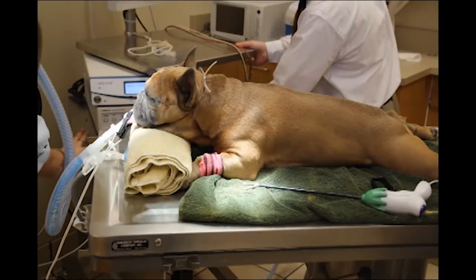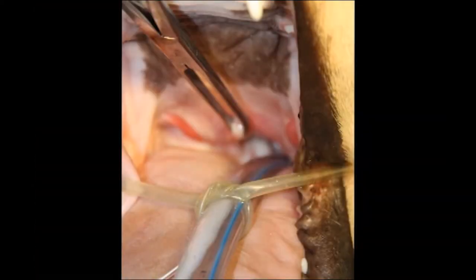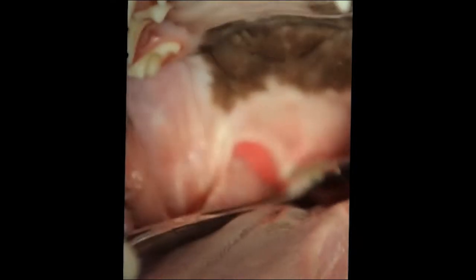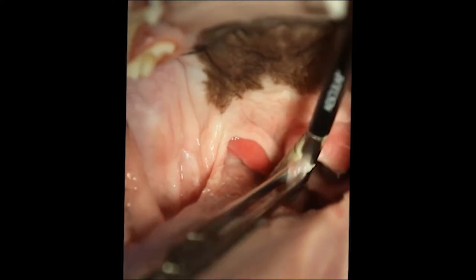You can also use a soft palate resection for brachycephalic dogs. The soft palate is evaluated, then retracted. The vessel sealer then seals and cuts the tissue. This is frequently a 30-second procedure performed at the time of a spay or neuter.